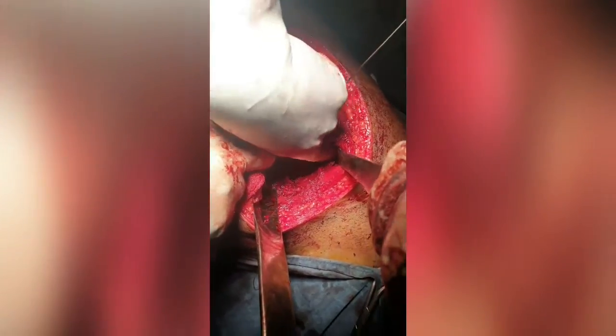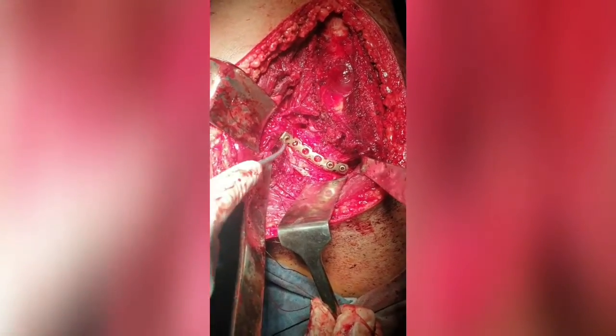So we have already reduced the posterior wall provisionally. See, we have reduced it with a K-wire and a screw. Now we'll give a reconstruction plate after bending. So this is the final construct.